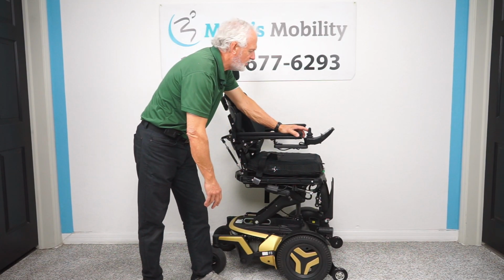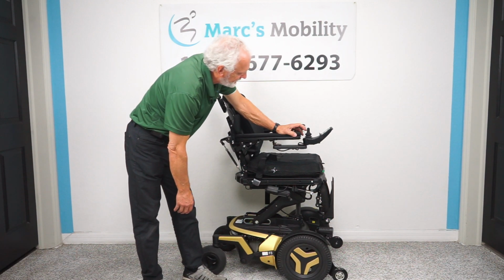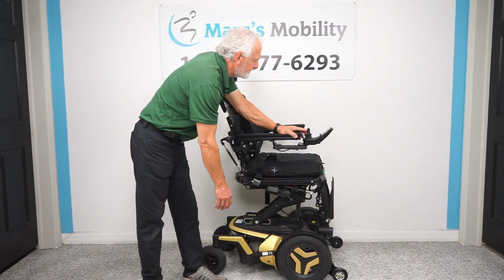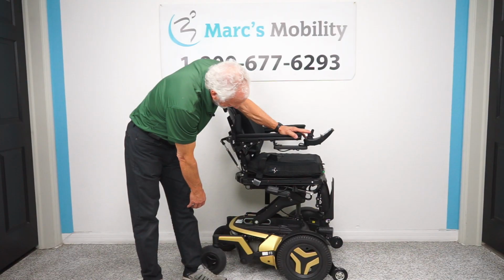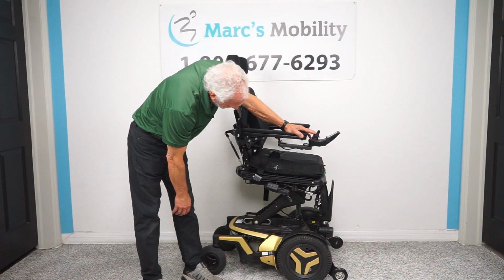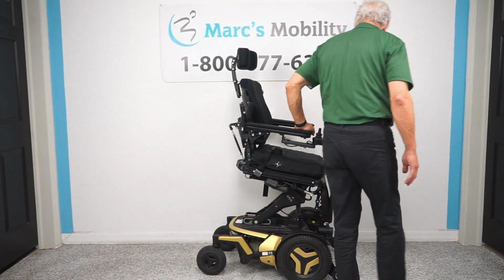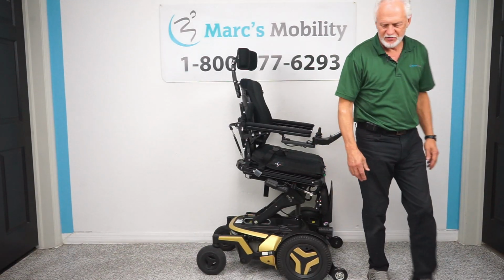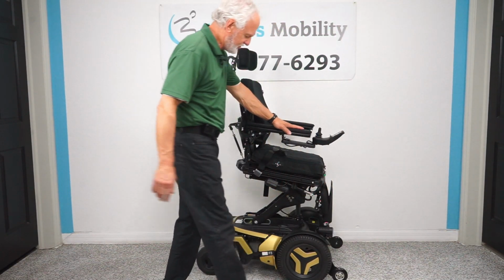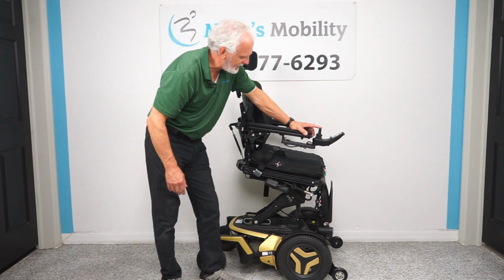but look at this. If we go here, watch the back tilt forward. Wrong one. Watch this. Sometimes it takes a couple tries and it goes. See it? It's tilting down. So folks, if you have this chair and you leave the seat elevated, you're out of the chair. That's how easy it is to get out of this chair with the seat. Even if you did not have this tilt forward, you could still get out fairly easy, okay?